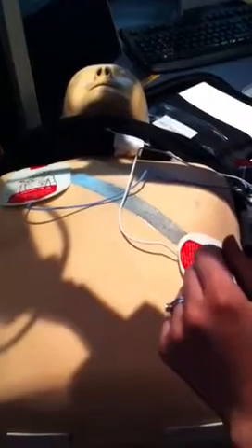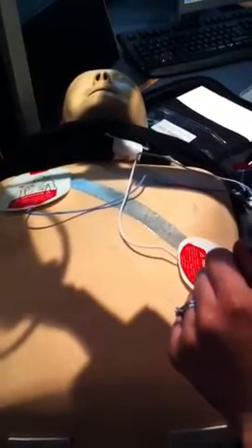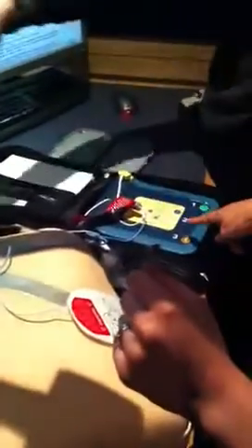Stay clear of patient. Analysing heart rhythm. Shock advised. Stay clear of patient. And now it's going to tell you to press the flashing orange button. And make sure now no one's touching him. Okay, so we're clear of him, and I'm the one who has to push the button for him. Deliver shock now.